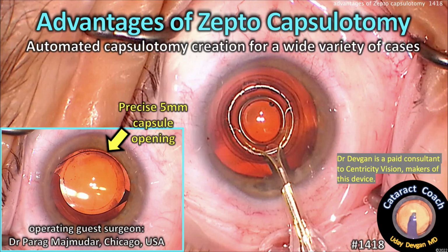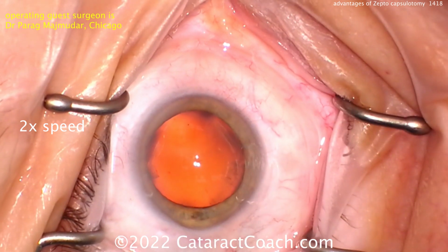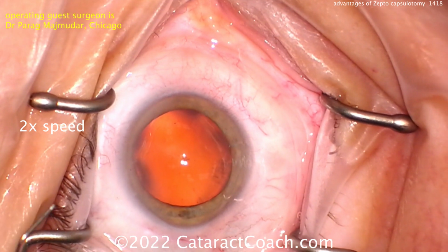CataractCoach.com. The advantages of Zepto capsulotomy, an automated way of making an anterior capsular opening for a wide variety of cases. I am a paid consultant to Centricity Vision, the makers of this device. This video, however, is not me operating.